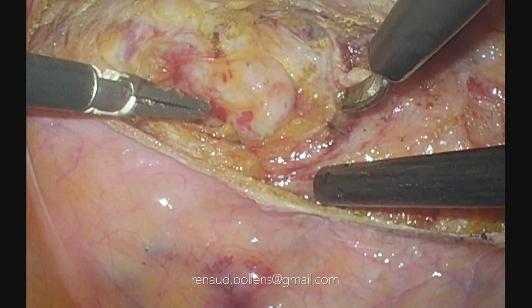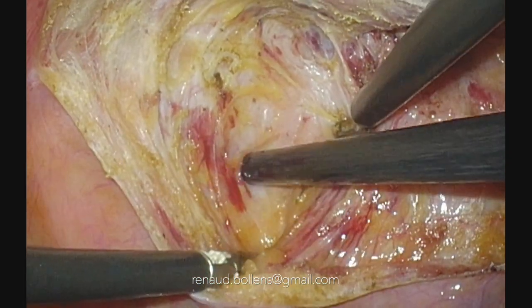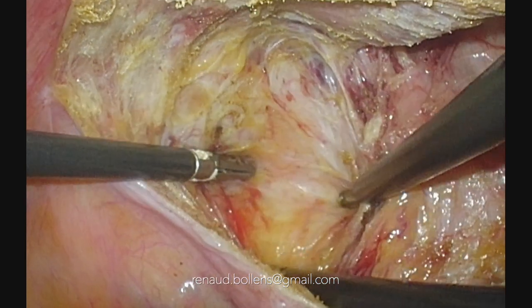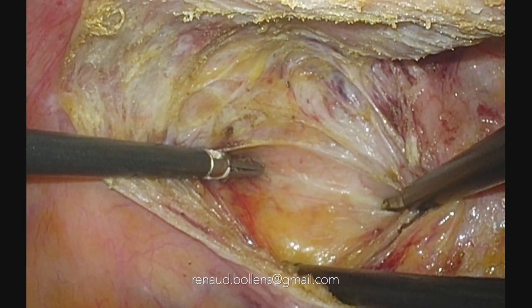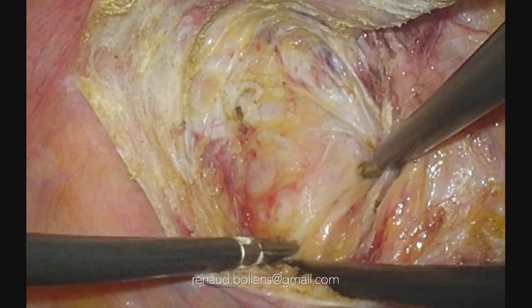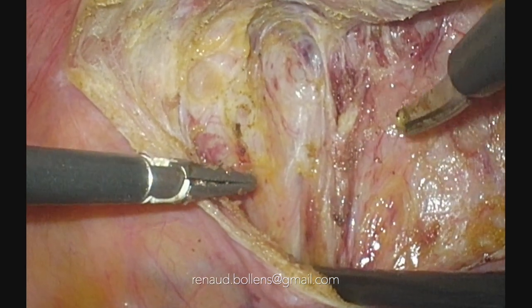Then to be more efficient, we can increase the number of directions of traction. Can you place the suction here? Then the suction gives one direction of traction. And with my two hands, I give two directions more of traction. You see already that the dissection is more efficient. Then we can descend deeper with the suction. Here, yeah. If you want, you can also put four directions of traction.